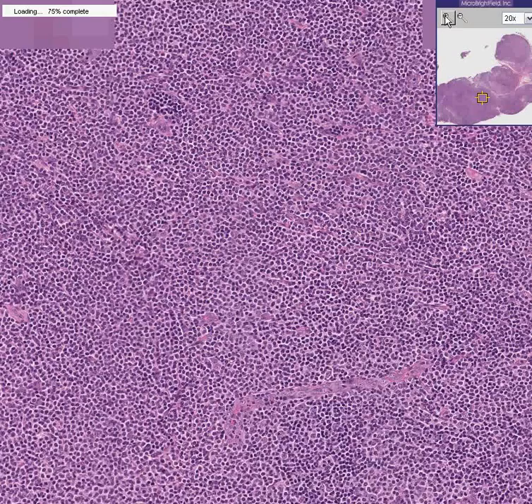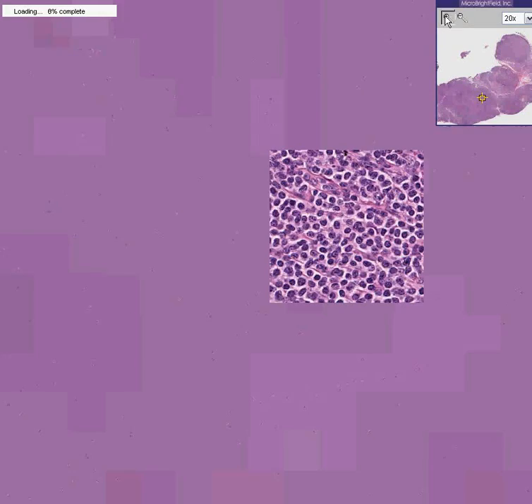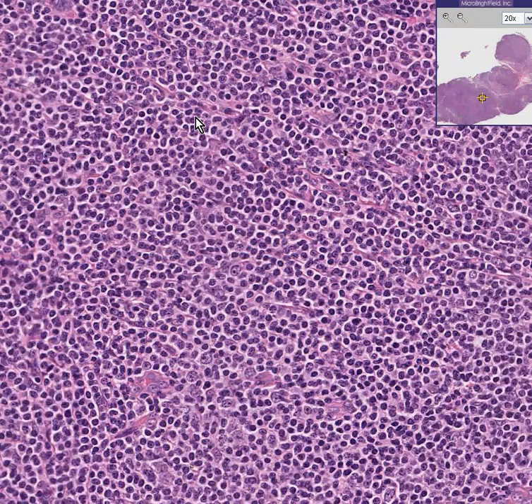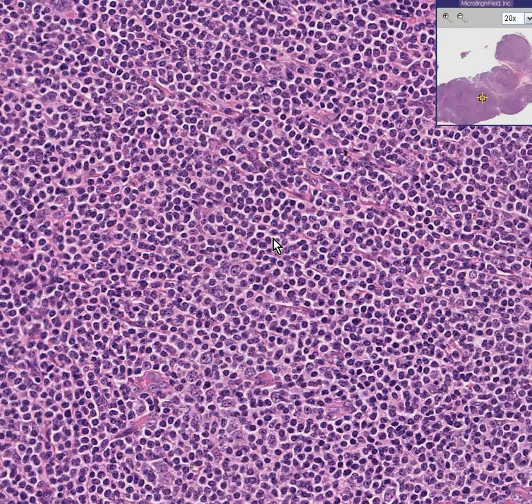The tumor is composed of these lymphoid cells — fairly small, fairly uniform, diffusely growing. So if you want to call this a diffuse lymphoma, you can because it is. And if you want to stain this with T or B cell markers and it comes out B, you can also call it a B cell lymphoma.